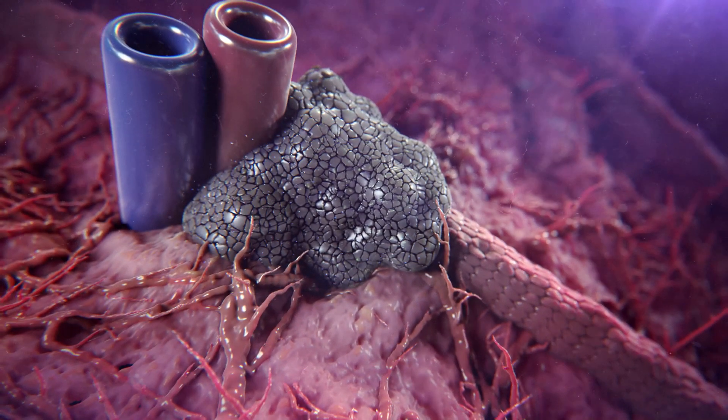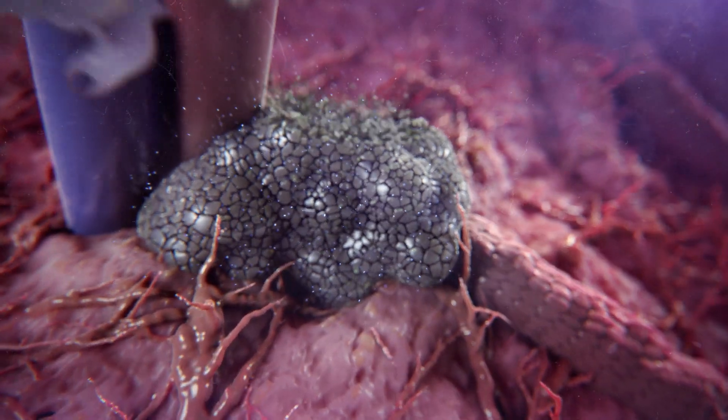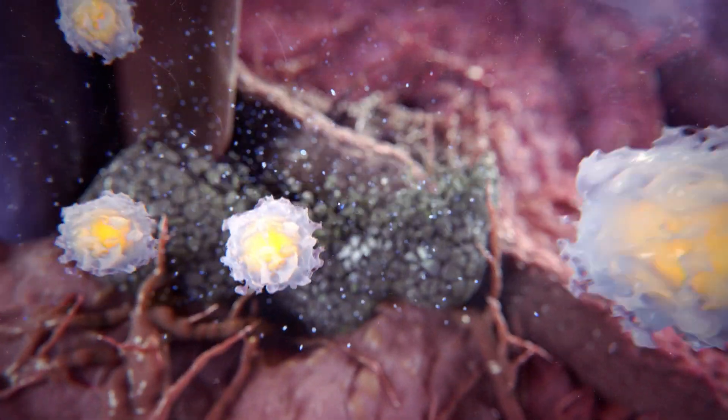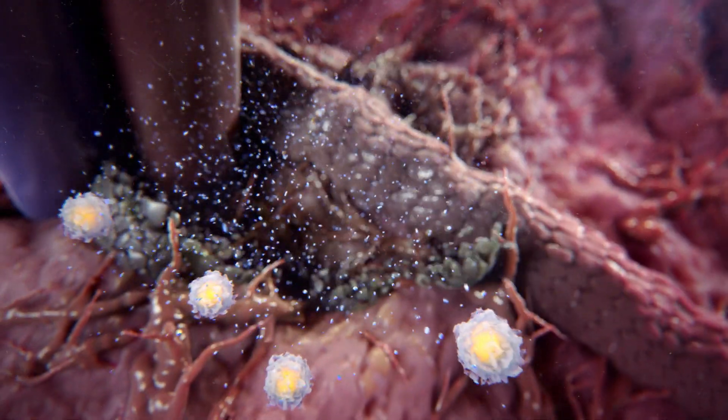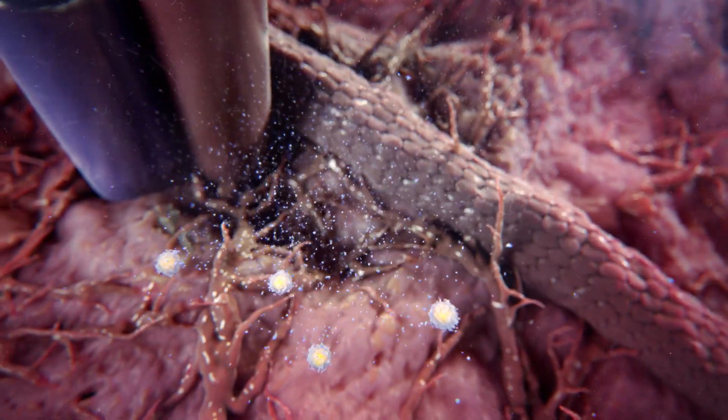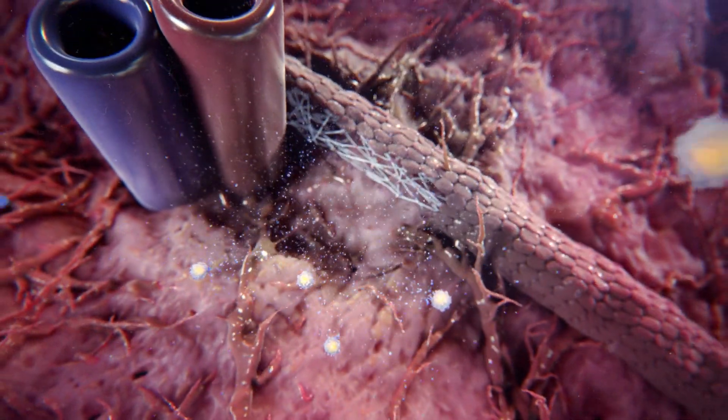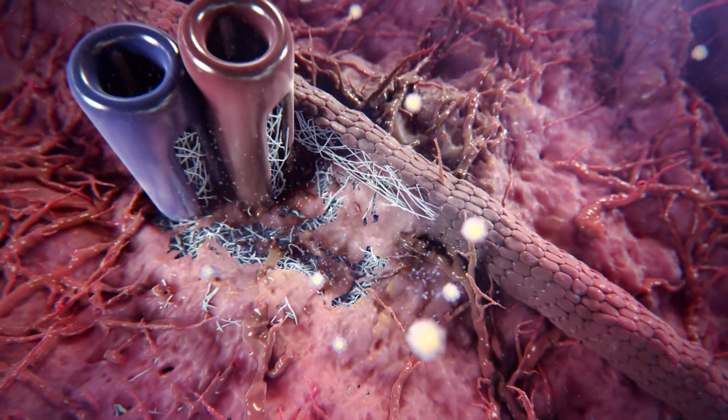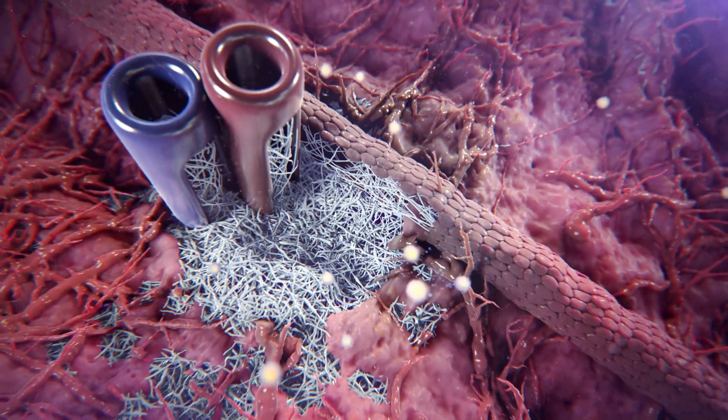This stimulus induces an apoptotic-like cellular death, resulting in the complete ablation of tissue within the electrode configuration. The body responds to the apoptotic-like cell death by initiating the removal of cellular debris.